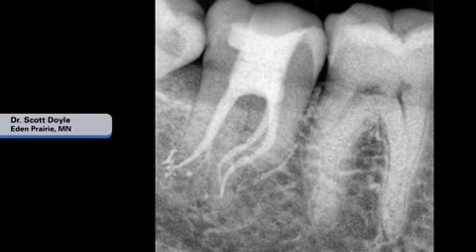I was really pleased when I received this radiographic image from my friend Scott Doyle. I've known Scott for many years. He's an endodontist. He used to be in the Air Force and he taught Air Force residents. Well, when you look at this image, his enthusiasm was that he used ProTaper Gold. Notice how difficult the anatomy is in the mesial system. And please especially note the last 2 millimeters is an abrupt 90 degree curvature distally.